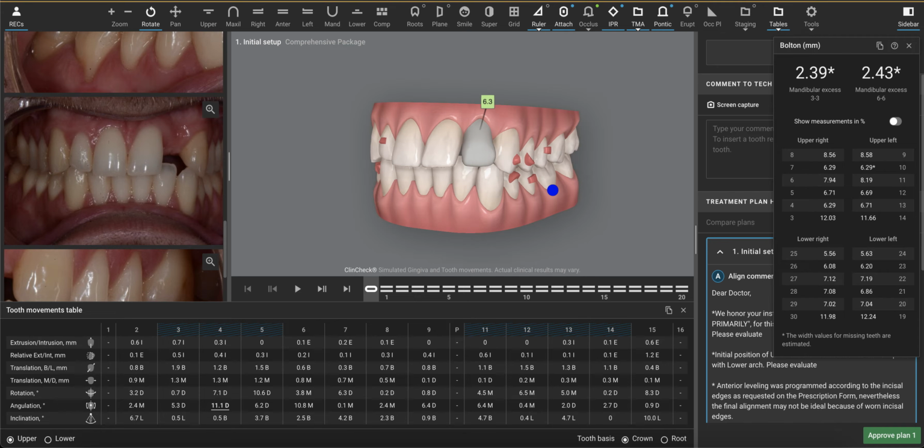I don't hate the idea. If I was going to do it, I'd do it off the canine. If you're going to do it, the upper lateral is probably the only tooth in the mouth that really lends itself to doing that, based upon the decrease in biomechanical load in most people.